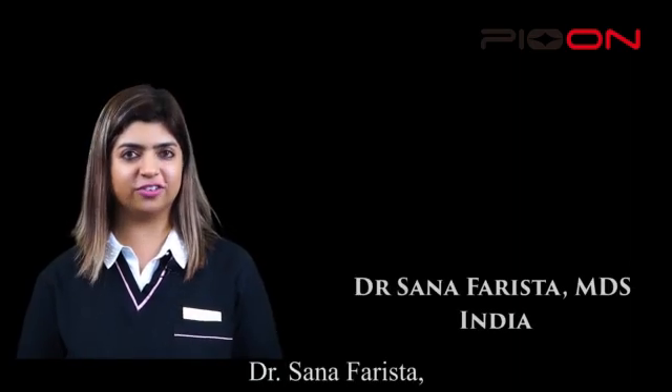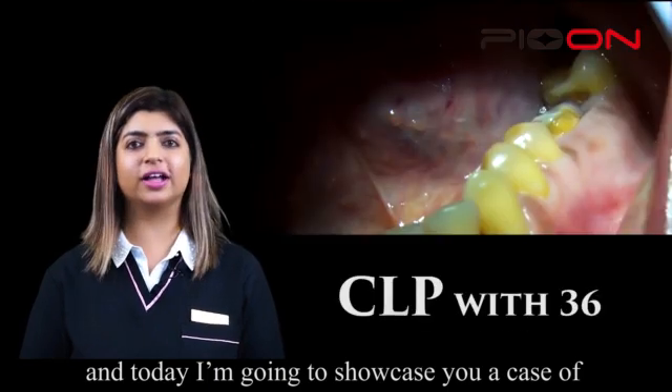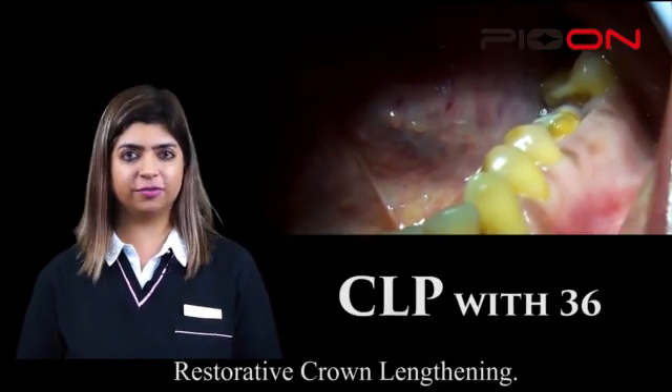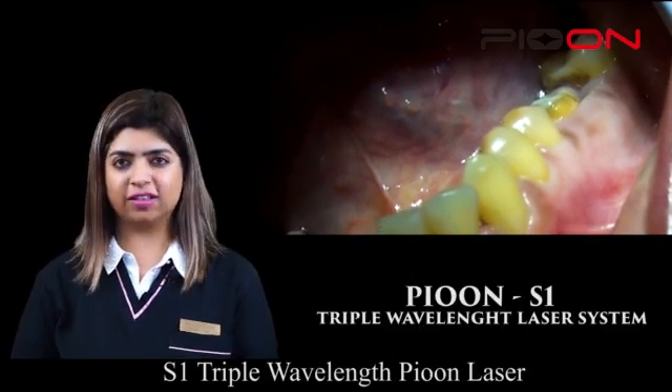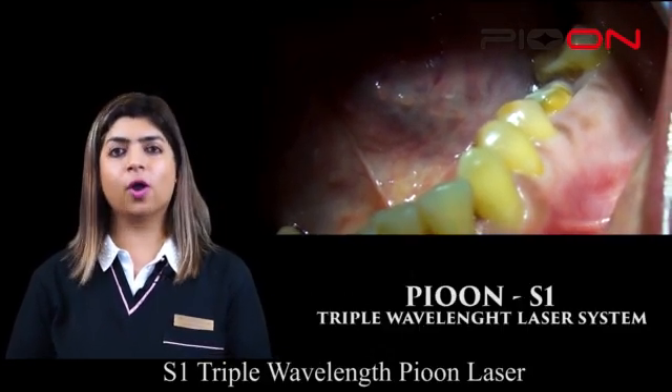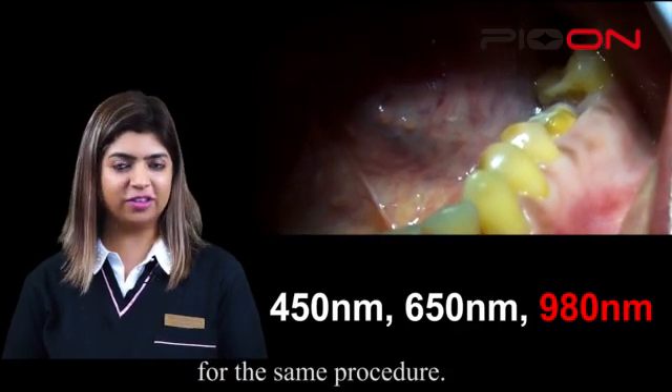Hello everyone, I'm Dr. Sana Farista, periodontist and laser specialist. Today I'm going to showcase a case of restorative crown lengthening. For this, I have selected the S1 triple wavelength Pioon laser, and I'll be using the 980 wavelength for the same procedure.